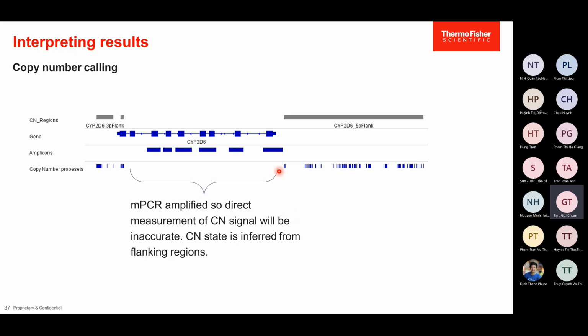And we don't actually do the one in the middle because we do MPCR, right? There's another PCR. So because of the other PCR, this copy number region becomes not very reliable because you are actually using the PCR to amplify that particular region. So if you analyze it, the copy number region is not accurate anymore. So that's the reason.